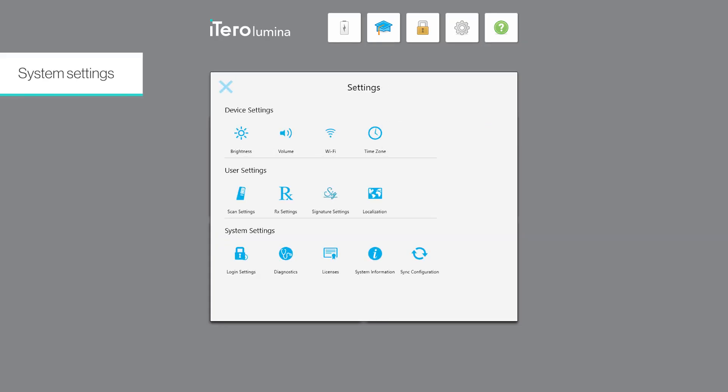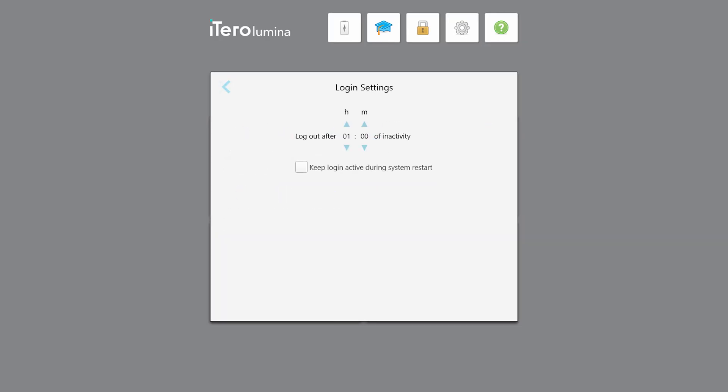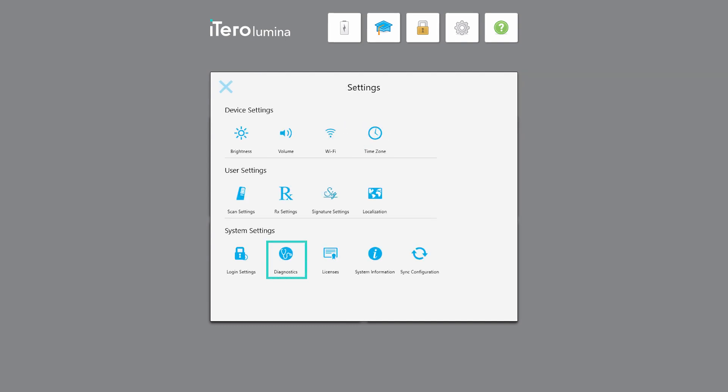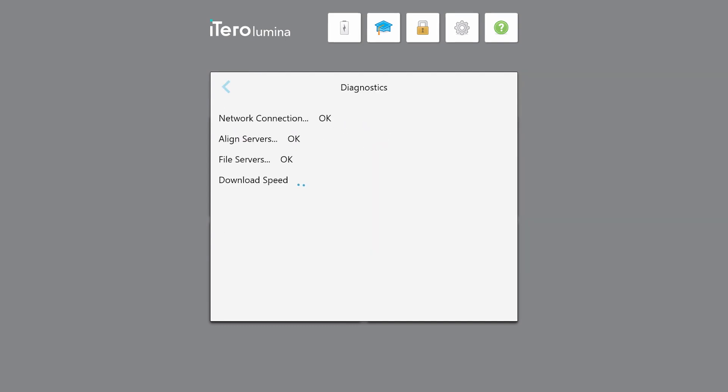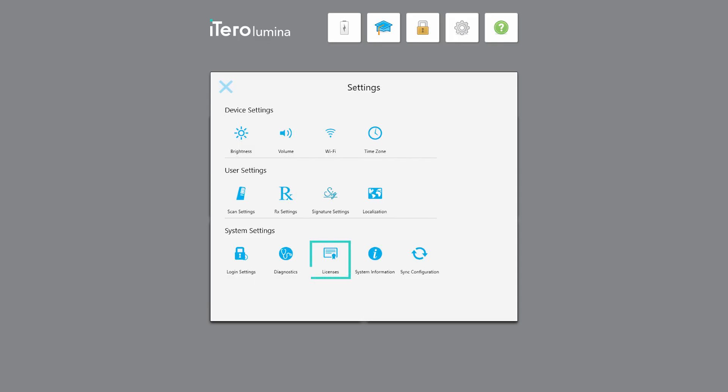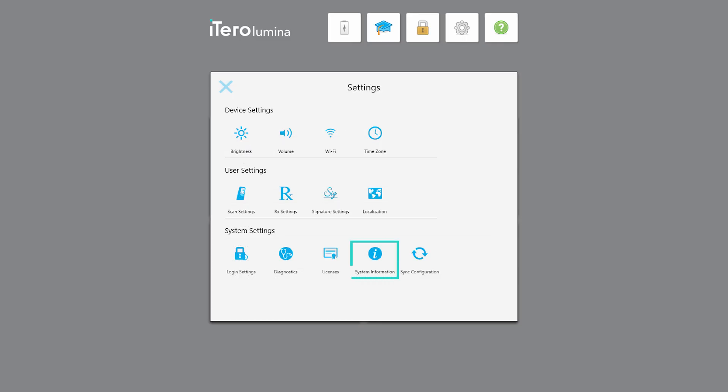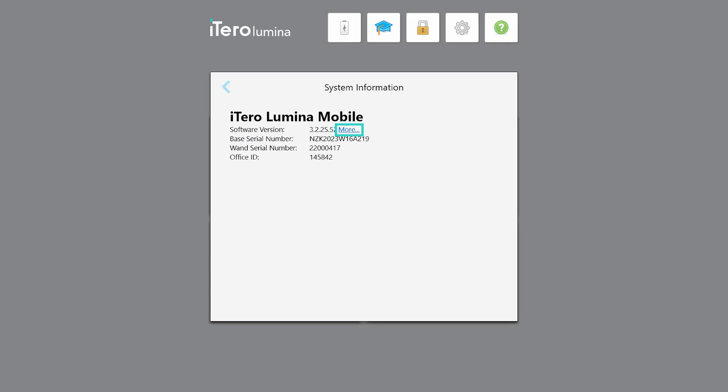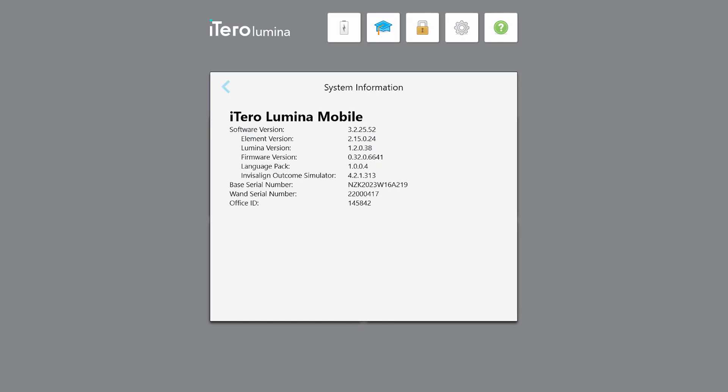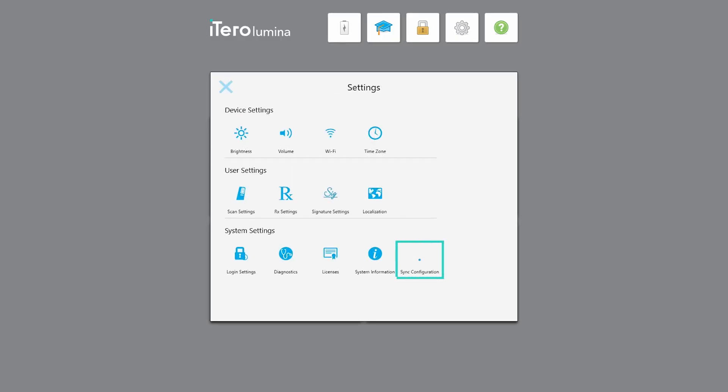In the system settings you can access the login settings, run system diagnostics to check the network connection and speed, access a list of all third party software components installed on the scanner, view details about the software versions currently installed on the scanner and hardware serial numbers, and synchronize any new updates from the server.